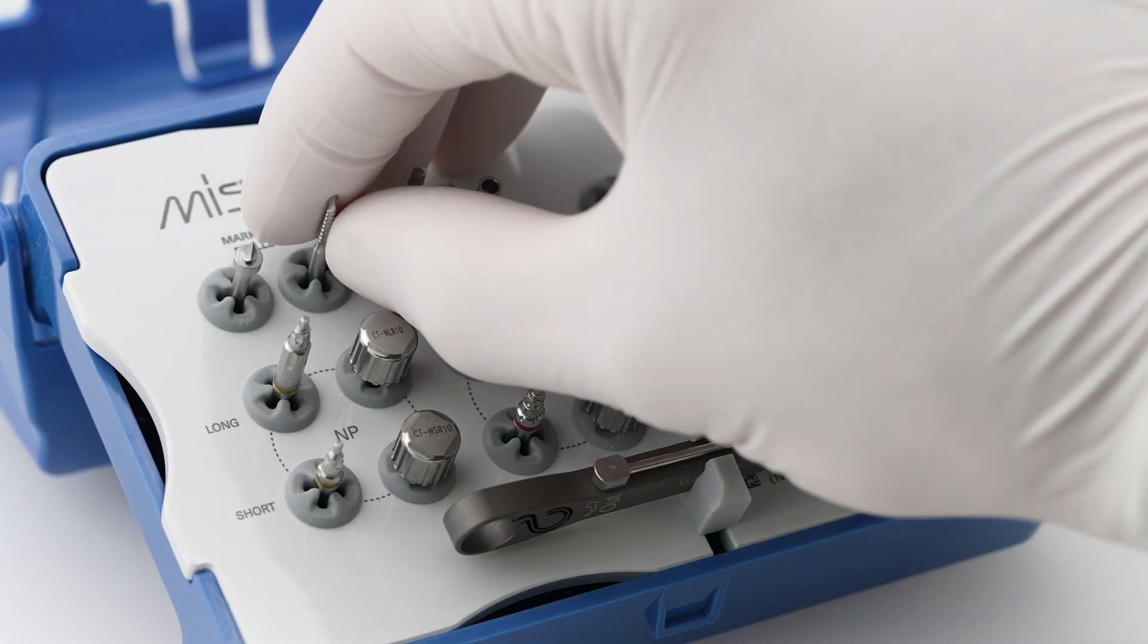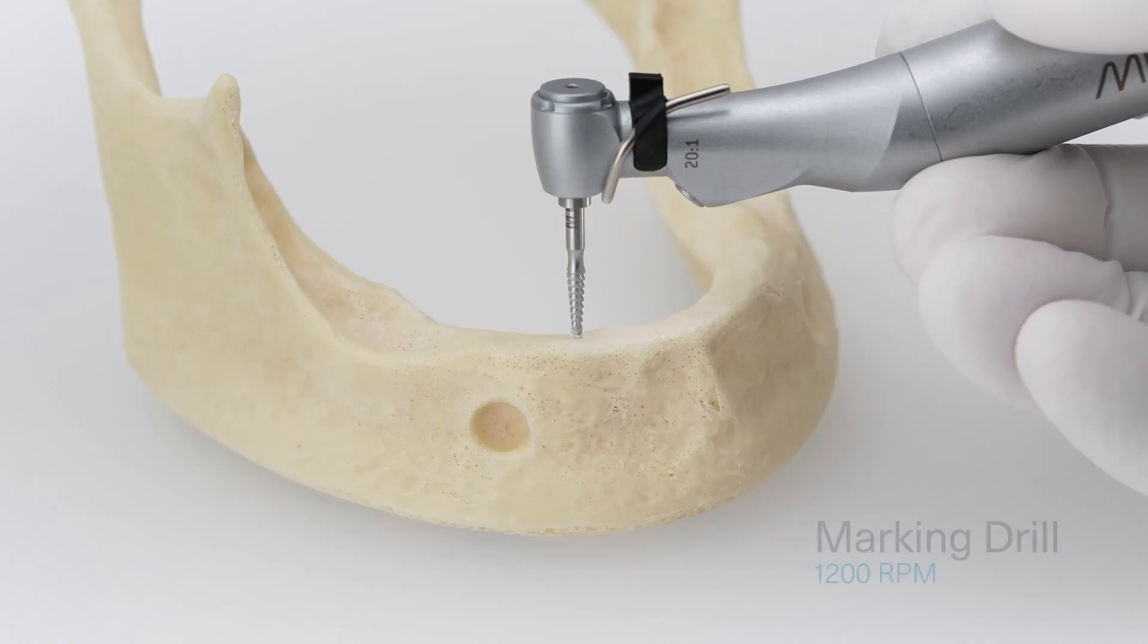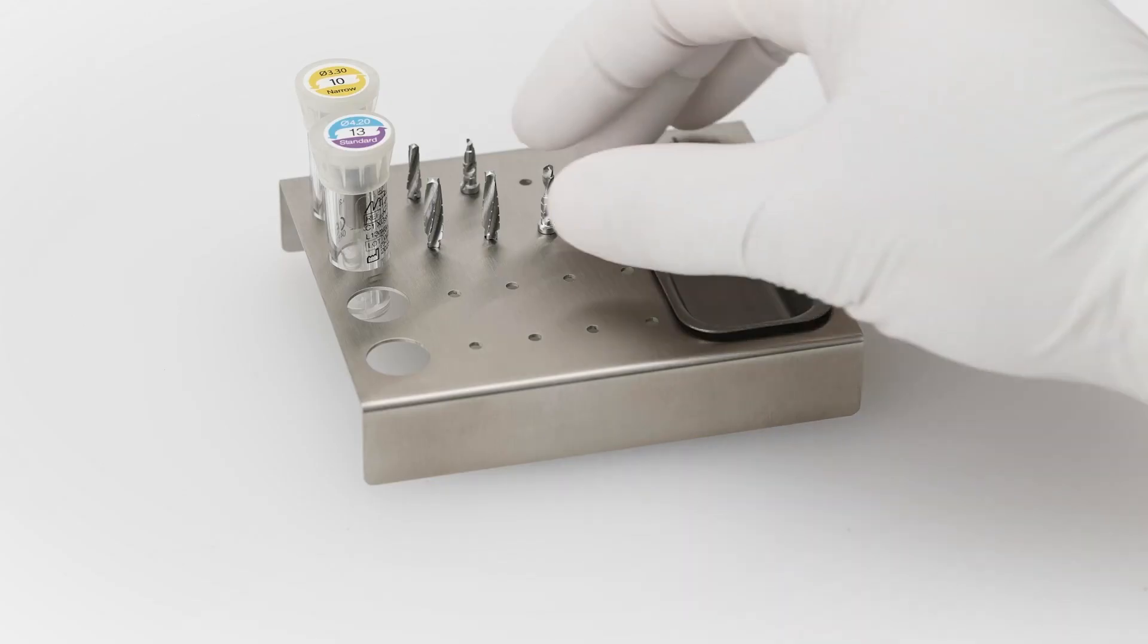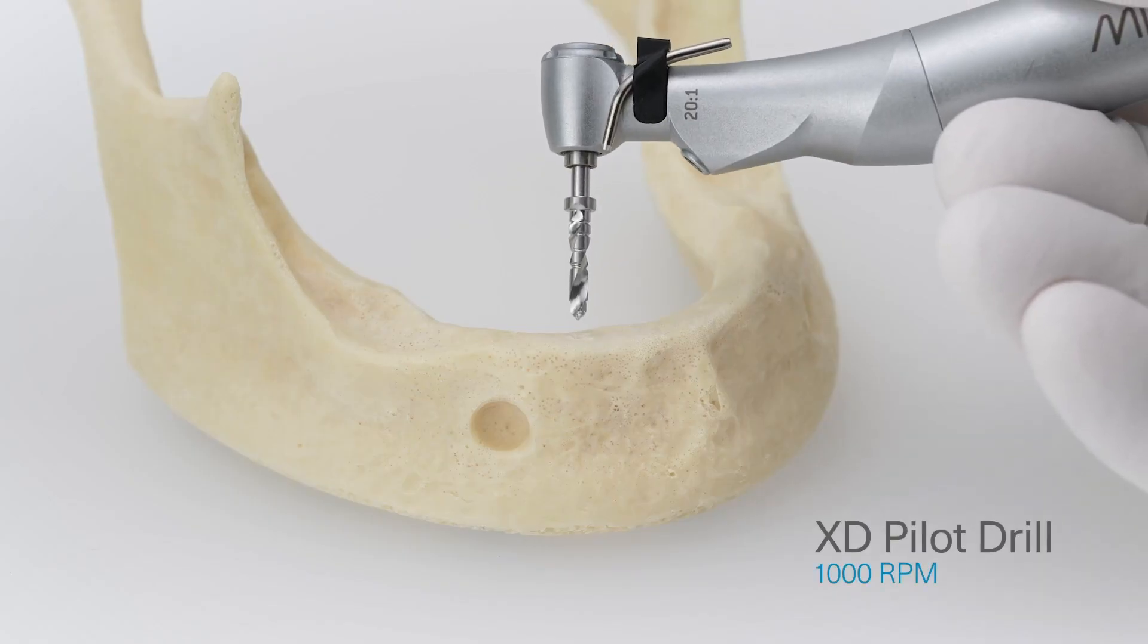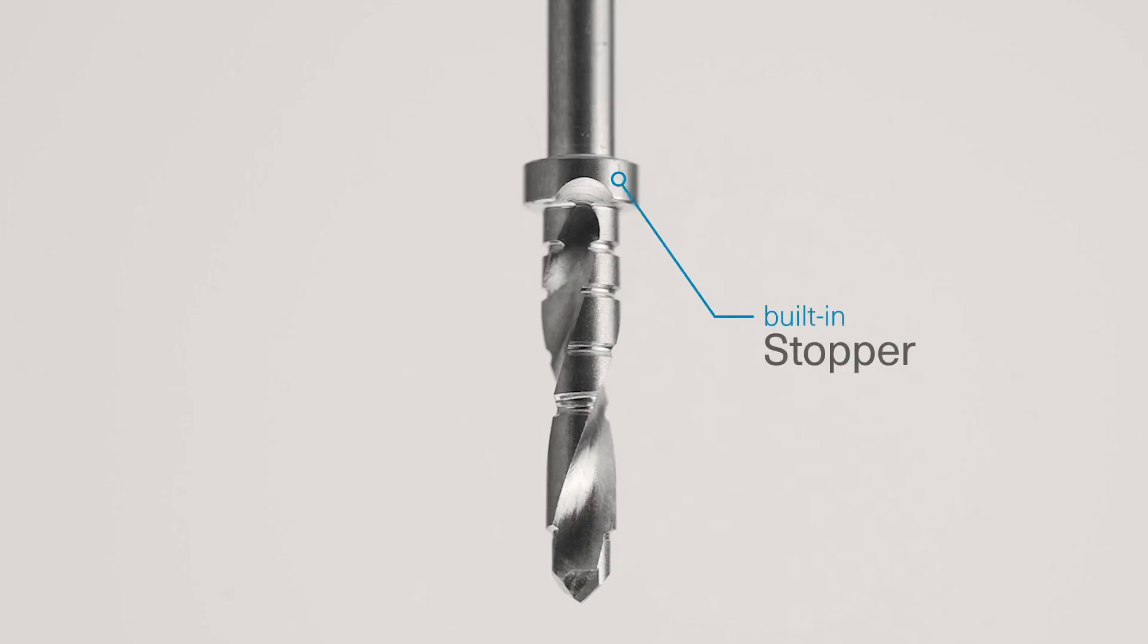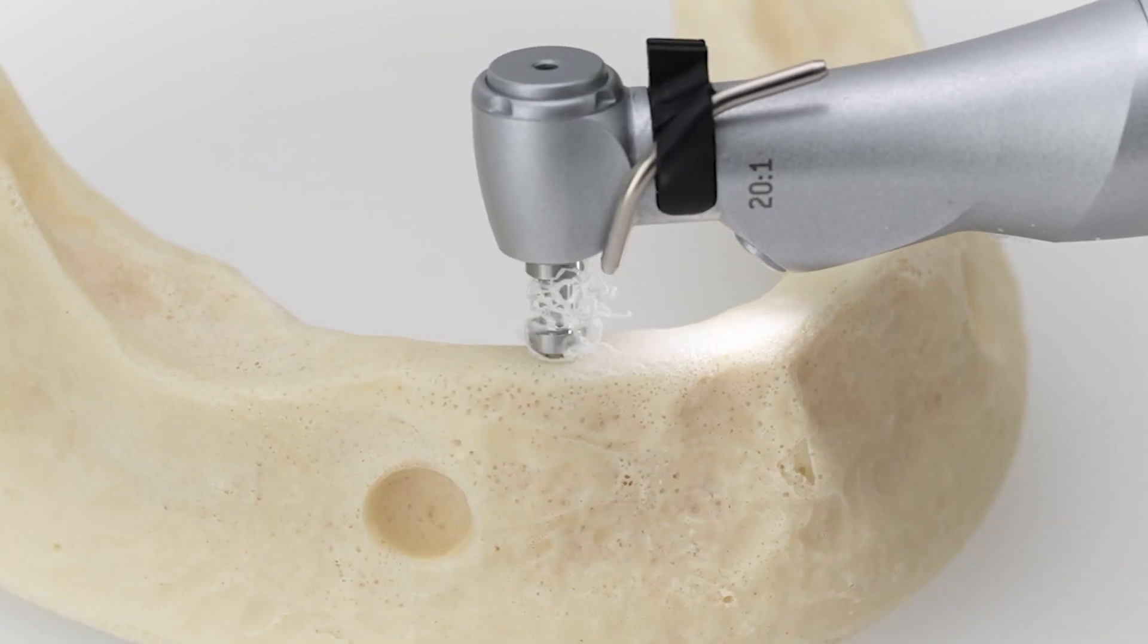Start the drilling sequence by using the marking drill from the XD placement set to indicate the positioning of the implant. After marking the correct drilling spot, continue with the XD pilot drill. The XD pilot drill features a built-in stopper and comes with a two millimeter diameter tip, allowing you to accurately determine the depth of the osteotomy.